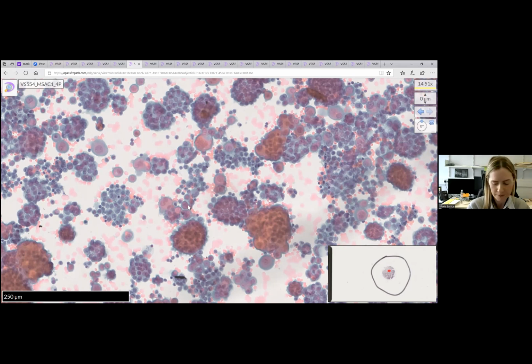Any questions? So yeah, that's great. I mean, it's a great case for the sake of all the discussion that we've had. I think as an examiner, if this was in a test situation, we would at least want you, on the basis of the morphology, to identify this as a mesothelial problem rather than an adenocarcinoma, or having even a differential diagnosis of adenocarcinoma versus mesothelioma.